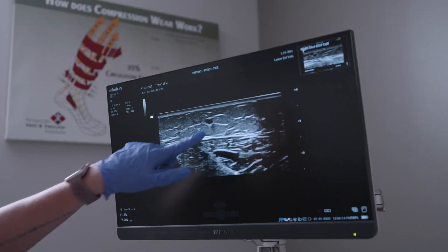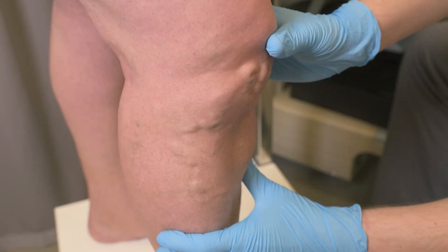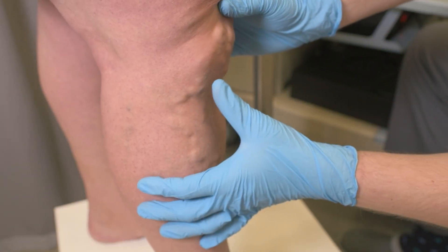Understanding your symptoms starts with a thorough diagnosis. We use an ultrasound machine to see the veins in your legs and watch the blood flow and determine where the valves are leaky and how severely the veins are affected. Because the blood flow is influenced by gravity, we tilt the bed upright or have the patient stand to better evaluate the valve function.